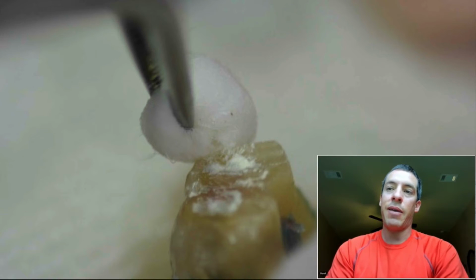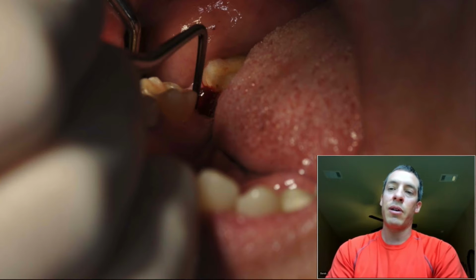After we cleaned it with the handpiece, we cleaned it with our ultrasonics, just like we do in all of our other cases. We got it ready to seal by packing in our BC sealer and BC putty, our root end repair material. Here you can see us with some dampened gauze, removing the excess. Upon reinsertion, we go as far apical as possible, being careful not to touch the sidewalls where the cells were, just to stimulate some bleeding. It's almost the same principle as an extraction. We just wanted to make sure that we weren't going to have a dry socket, and the bleeding is basically our first step in the healing process.